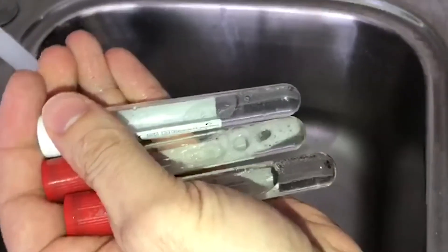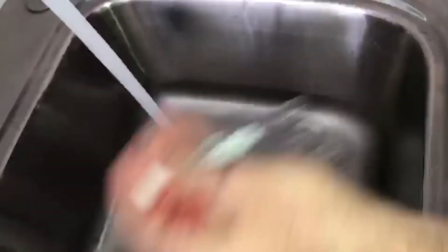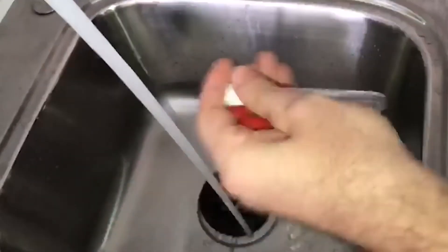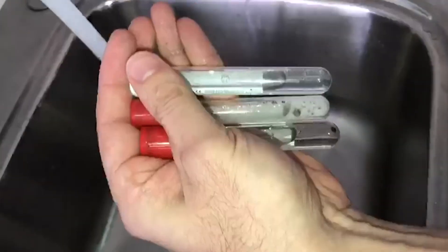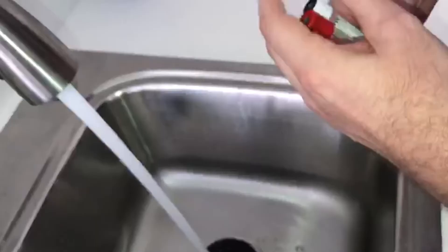Shake these again — take a look at the differences. That one has not been cleaned out, so there's a really huge difference. It's a very simple test you can do with whatever tubes you're buying to figure out what's actually inside your tube. It's totally disgusting what's coming out of these ones.